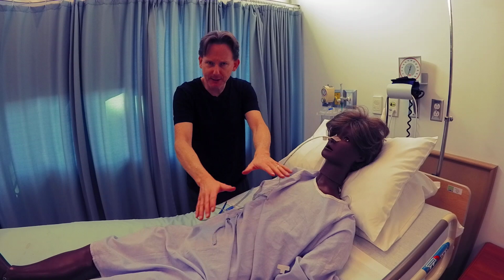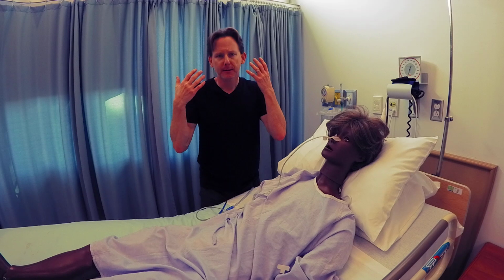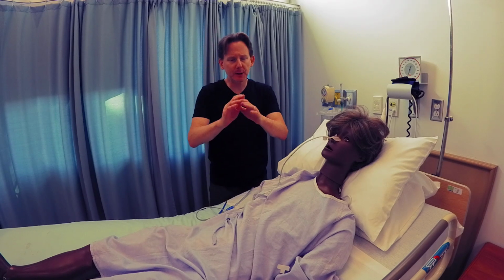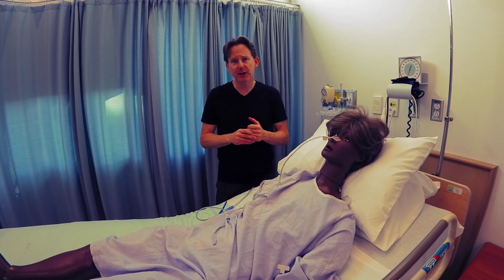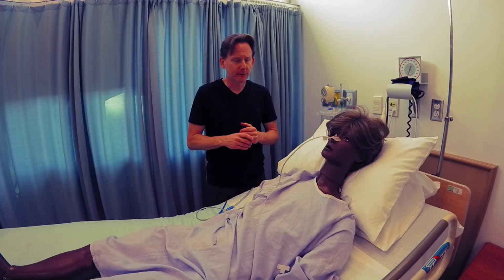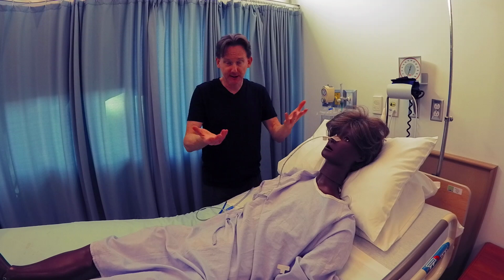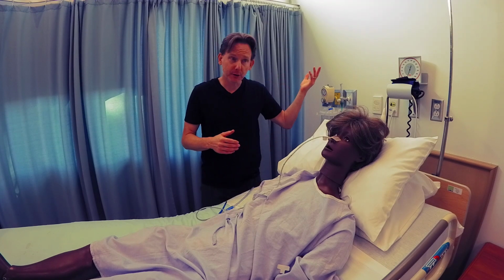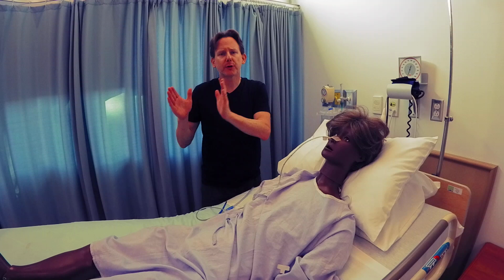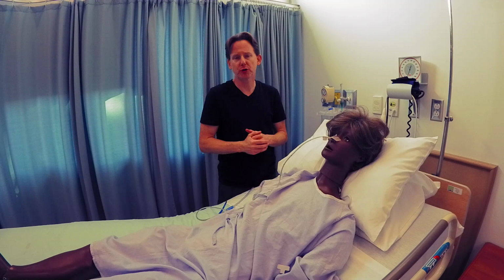And then we'll do our associated abdominal assessment, which is in another video, around examining, listening, and palpating. So let's say we've done all that and we're happy with that. Now, by the way, if the patient is complaining of nausea at this point, of course, we're going to take that in consideration as we assess our NG tube, and when we consider our interventions, like maybe we need to check placement of the tube with x-ray. Maybe we need to offer an antiemetic. But we'll leave those for a different video. Right now, here's just how the basic assessment of the nasogastric tube system looks.